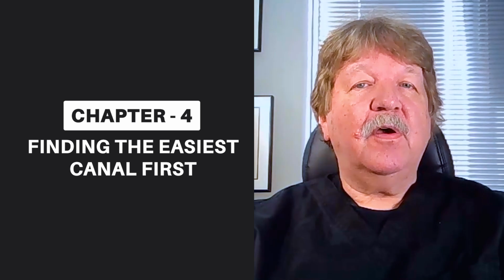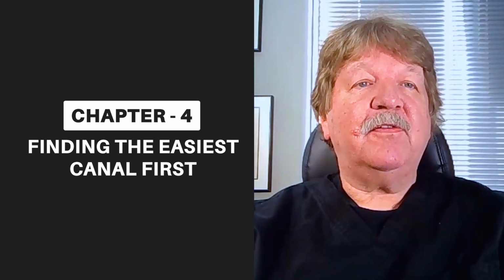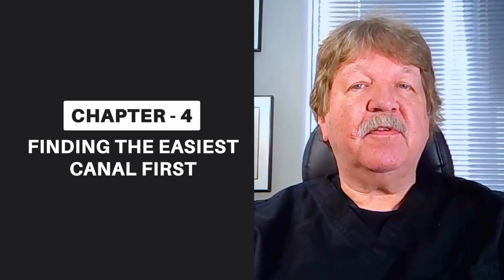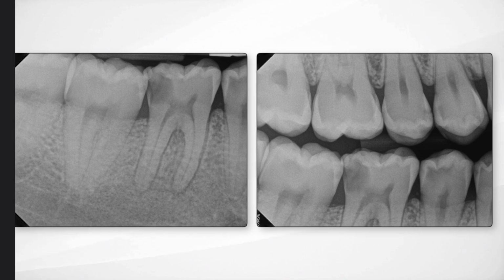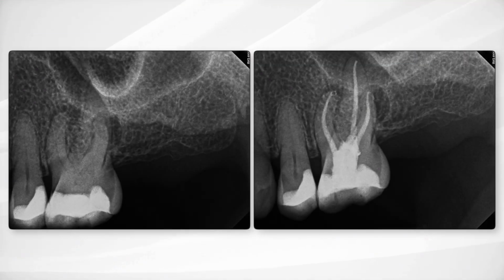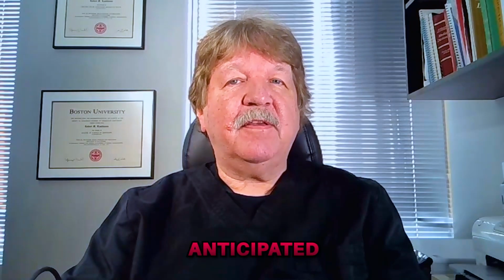Prior to access, we need to closely examine not only the PA, but the bite wing image to give us an idea of how far the chamber may be from the occlusal aspect of the tooth. Younger natural teeth will have large chambers that are easily penetratable. Older, heavily restored teeth will have chambers with large pulp stones or heavy secondary dentin deposition. This makes chambers hard to locate. These findings have to be anticipated before we attempt our access.